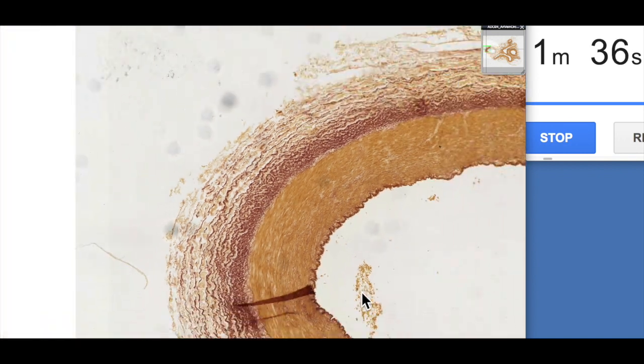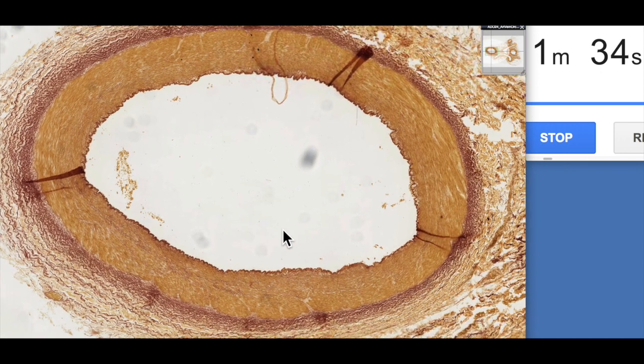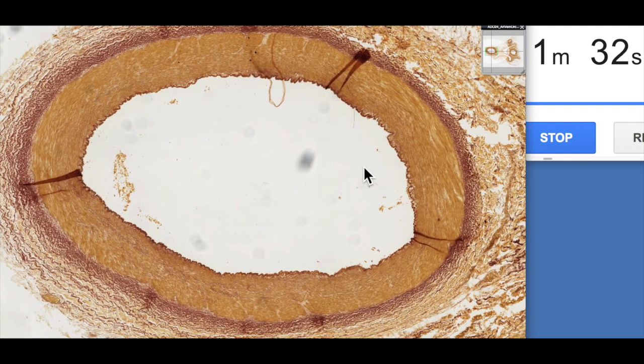If we sort of zoom out, we can see a real characteristic feature of arteries is that it's typically regular in appearance and shape. It's got a very thick wall with a very thick tunica media.